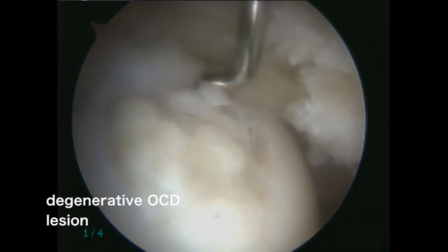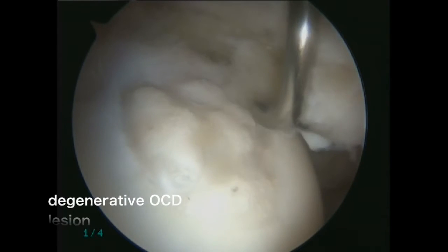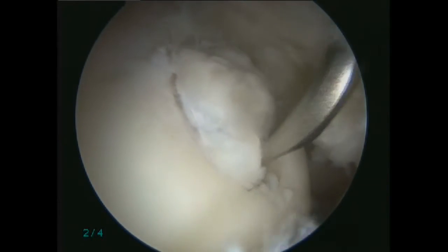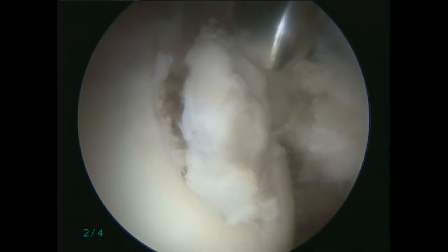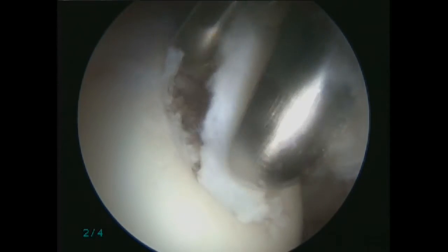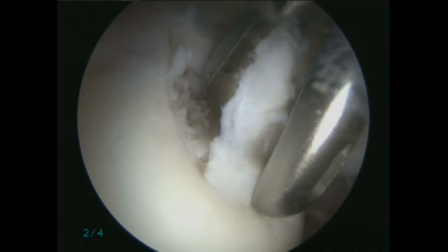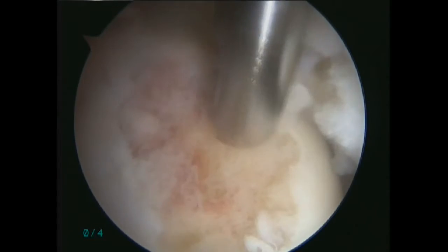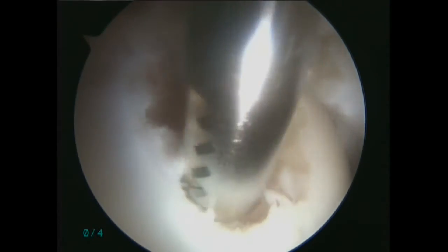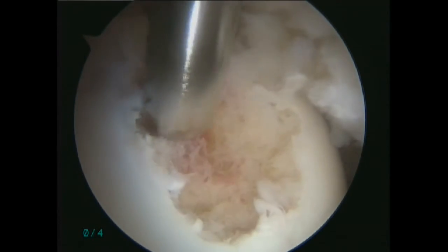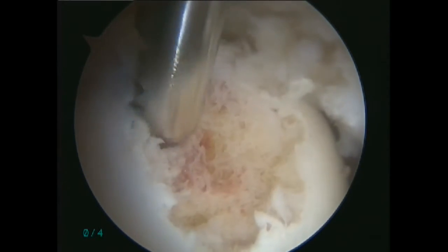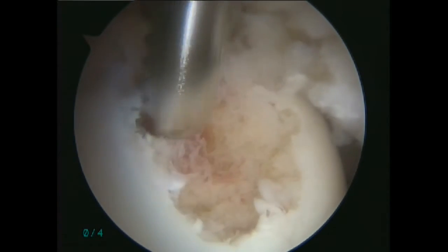The degenerative cartilage region was resected, and then the OCD region was debrided using a shaver.